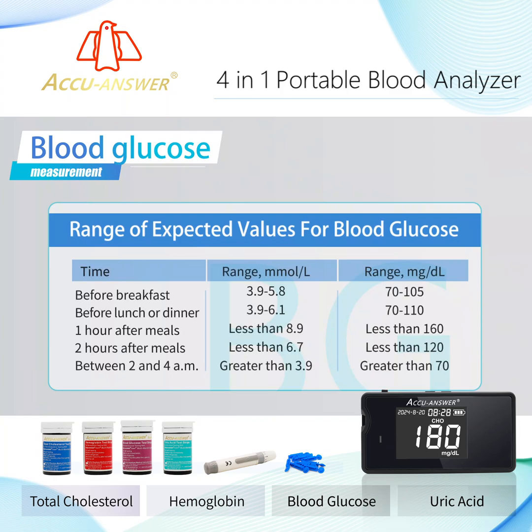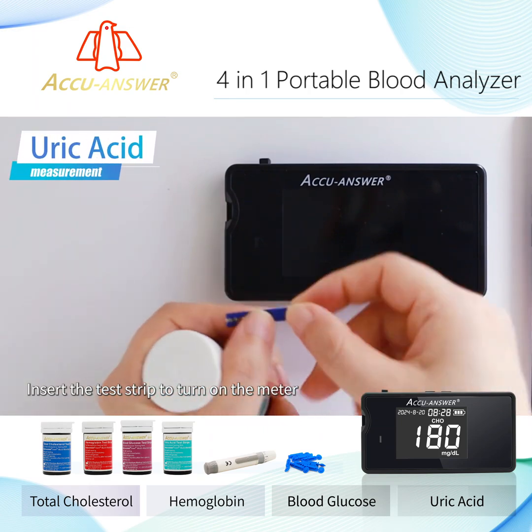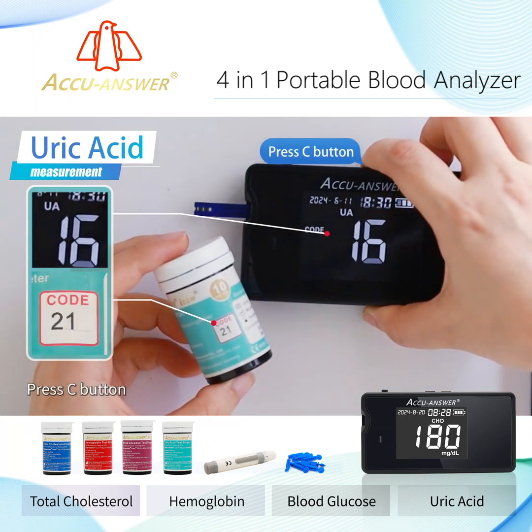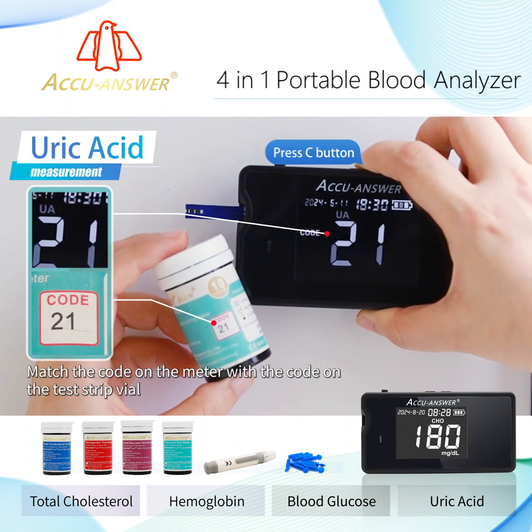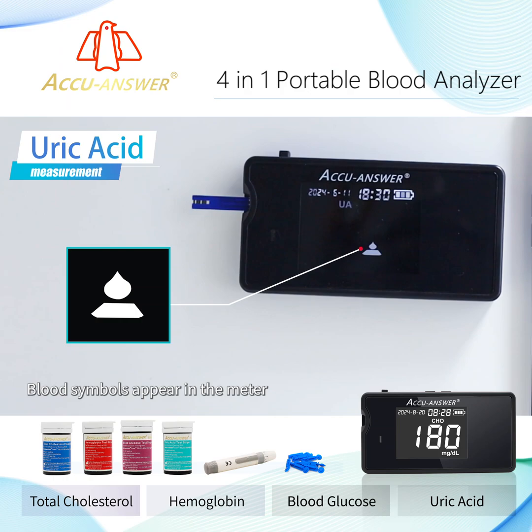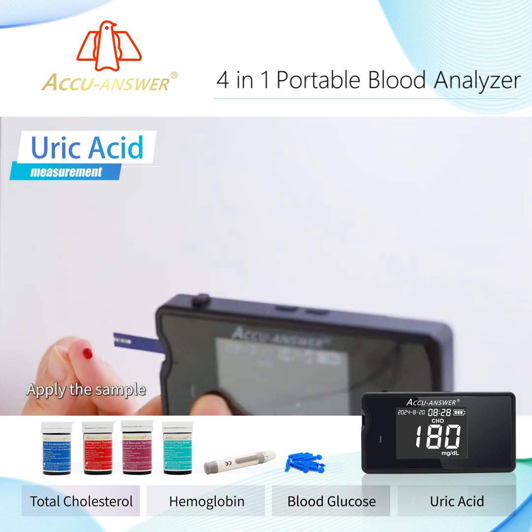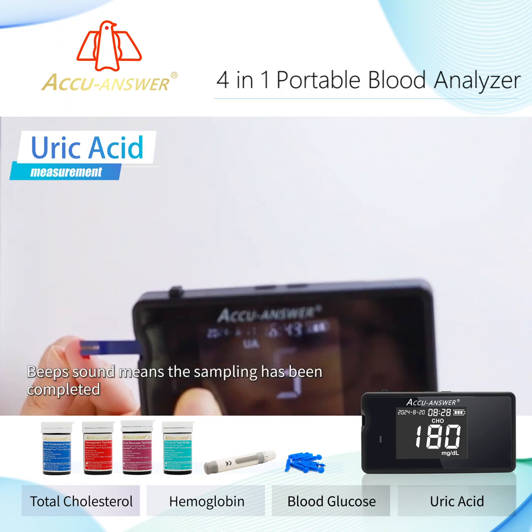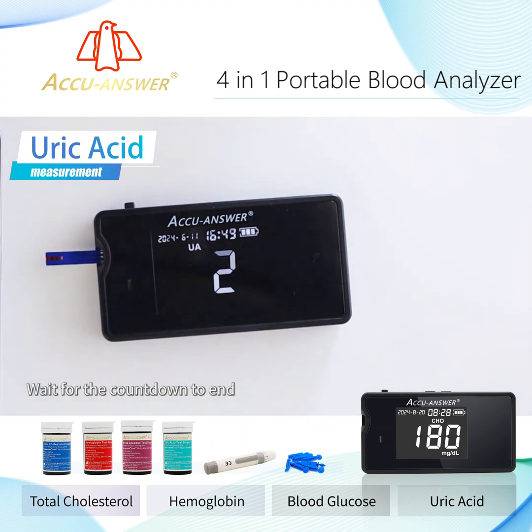Range of expected values for blood glucose. Insert the test strip to turn on the meter. Press the C button and match the code on the meter with the code on the test strip vial. Meter and test strips matched successfully — blood symbols appear on the meter. Apply the sample, the sample channel touches the drop of blood and siphons it in. A beep sound means sampling is complete. Wait for the countdown to end and the meter will display the results.